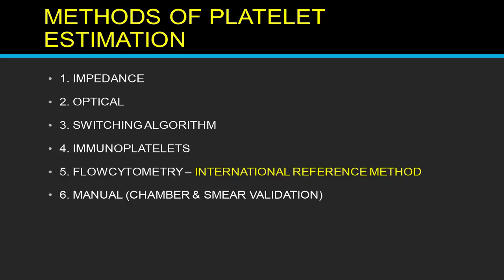And then most of these analyzers now have something called the switching algorithm, where the analyzer decides based on certain parameters whether impedance is more suited in this condition or an optical platelet is more suited.